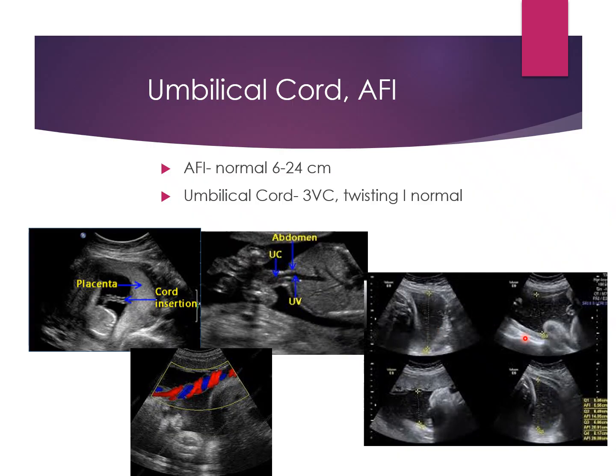I also just want to point this out. So when I was talking about the 3-vessel cord, you can actually see there's your 3-vessel cord right there. So if you're kind of wondering what it looked like.